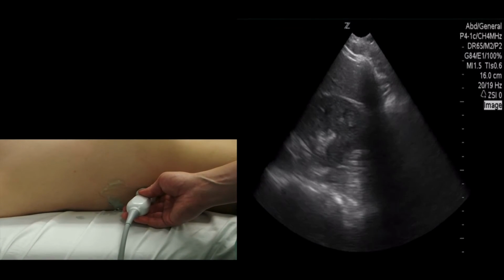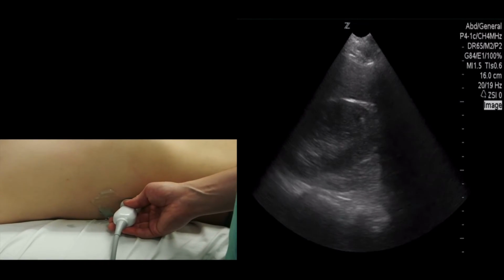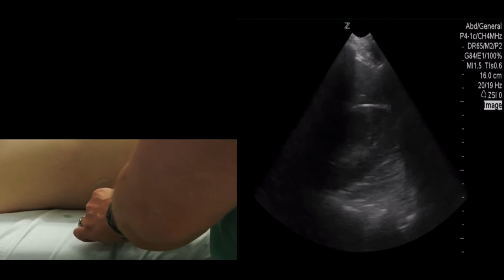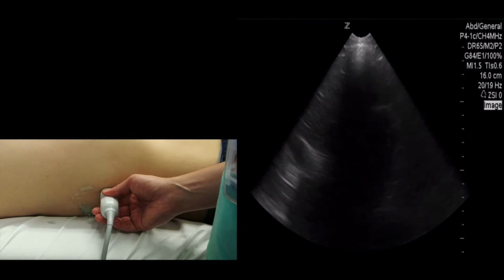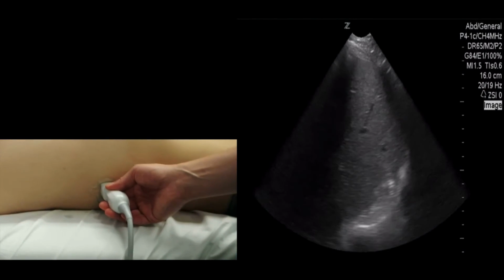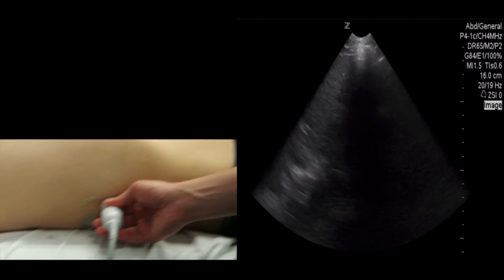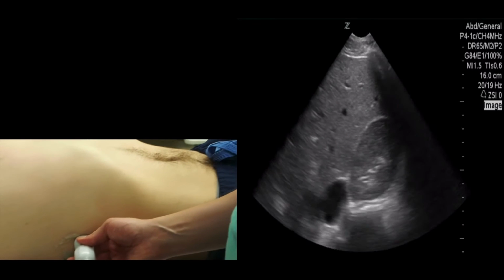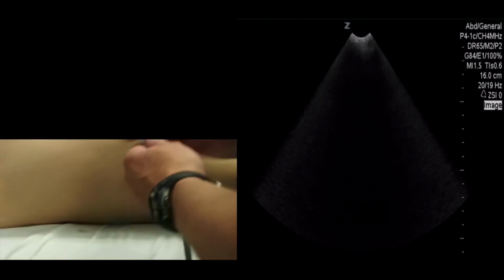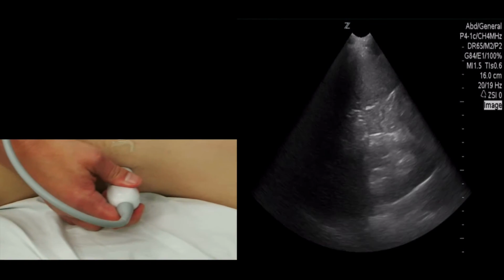After we're done evaluating the kidney in the long axis, let's transition to the short or transverse axis. Now rotate the probe 90 degrees and point the indicator up towards the patient's belly button or up towards the ceiling. Now we want to interrogate the entire portion of the kidney in the short axis. How we do that is we now angle or fan the probe cephalad and caudad, looking at each pole of the kidney, and we can also move rib spaces, cephalad and caudad as well. We really want to concentrate on the pelvis portion of the kidney because that's where the hydronephrosis will be.